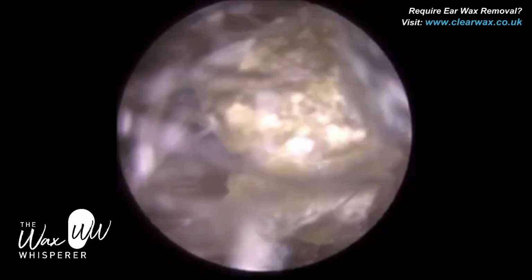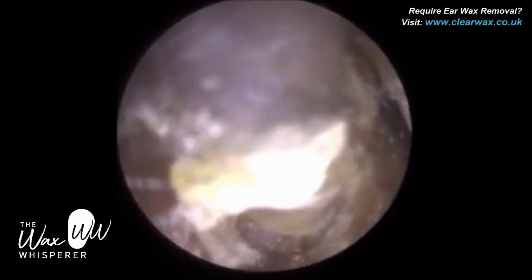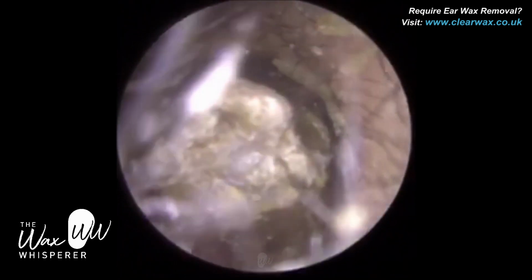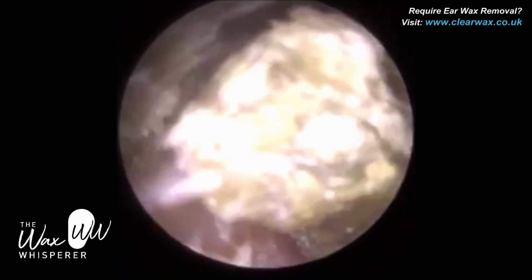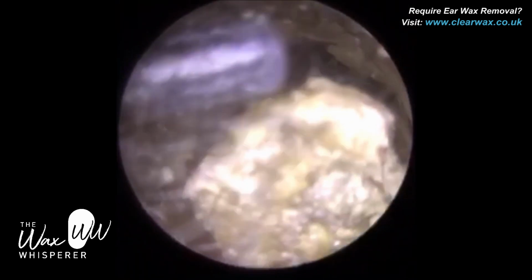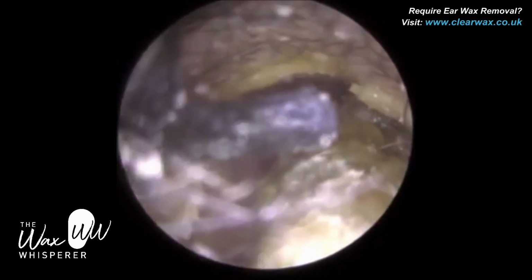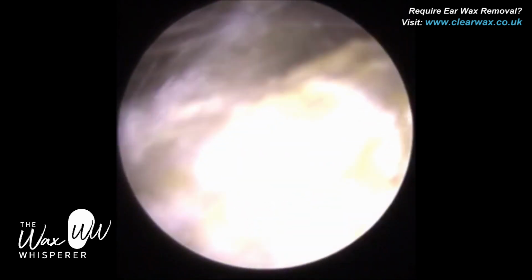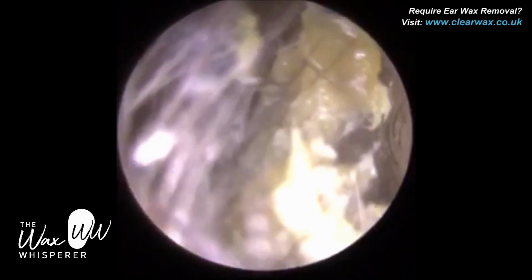If you remember before, I explained there's two narrowings, two isthmuses in the ear canal, one about 1 centimetre into the ear canal where the bony part and the cartilaginous part of the ear canal meet, and the second narrowing is 1/2 centimetre away from the eardrum. And this plug of wax is stuck in the narrowing, so we have to put a bit of force bringing it forward. So I've just put an ear hook in here.